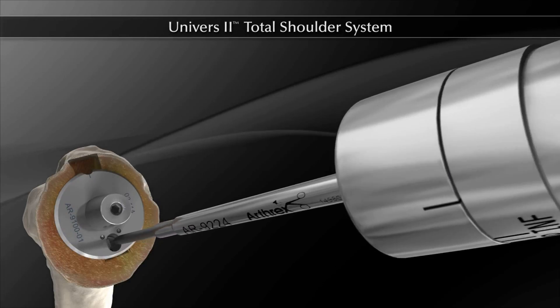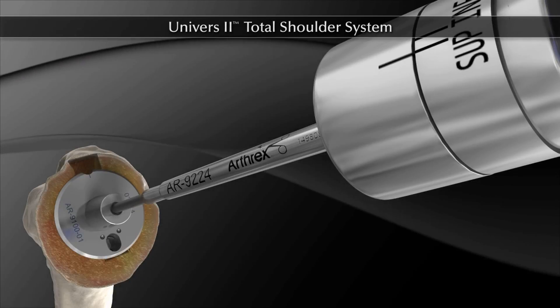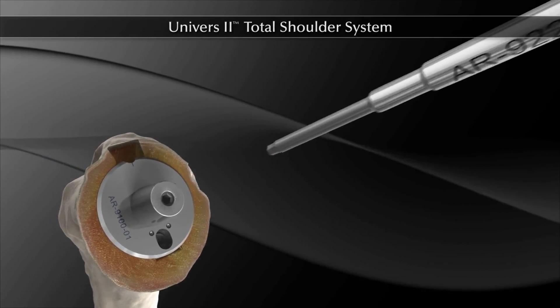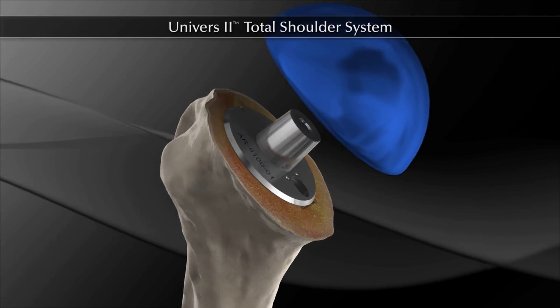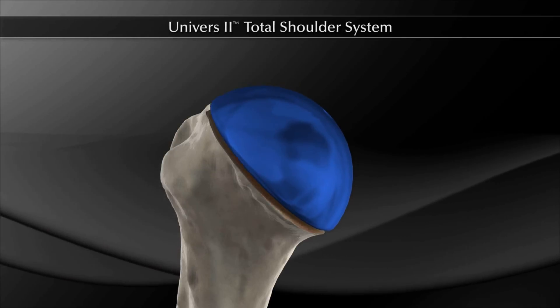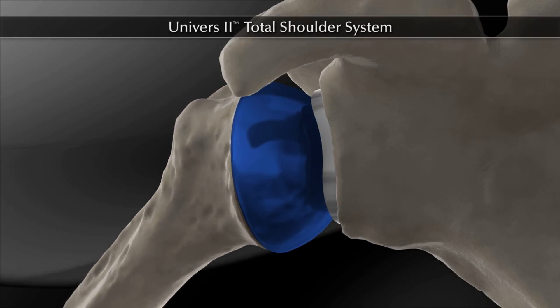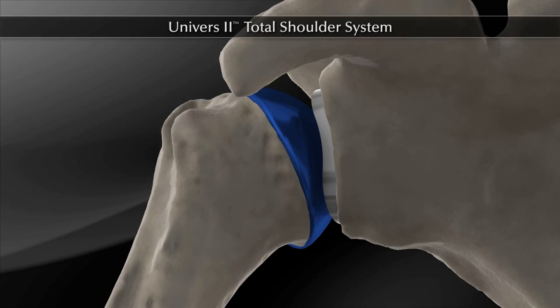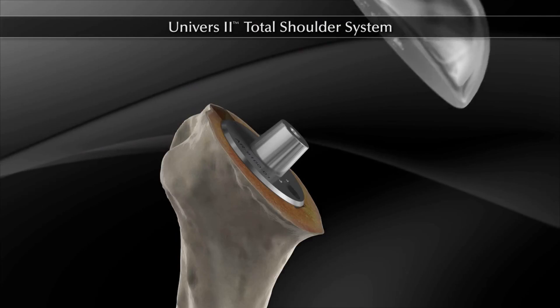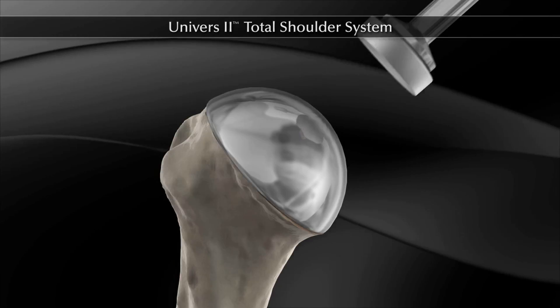Next, the torque driver is used to tighten the version screw located on the Morse taper by visually confirming that the SUP mark is rotated past the indicator line on the torque driver. The appropriate trial head is chosen and, taking offset into consideration, the head is rotated into the correct position and pushed into place. A trial reduction can now be performed. After the trial reduction, an implant head is rotated to the correct offset and impacted onto the stem using the head impactor.